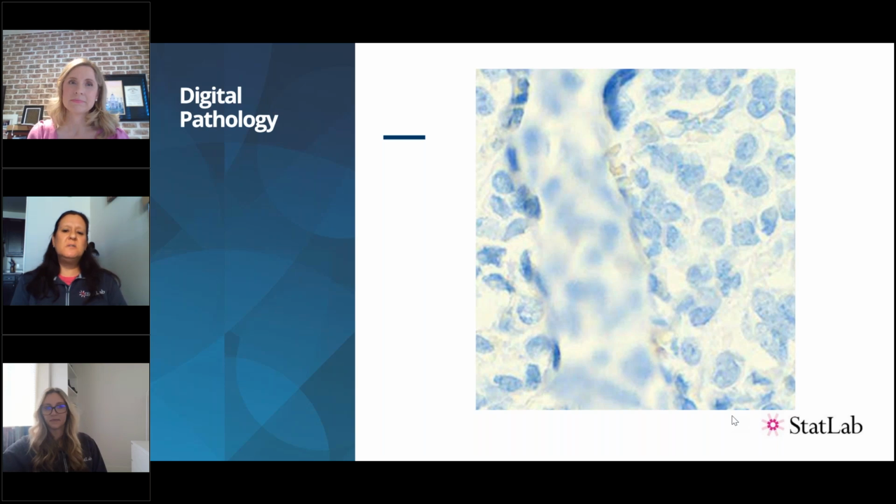So this is fairly new to me as well. This was a piece of tissue where, when I was just looking around the slide, I saw an area that looked like maybe there was some excess mounting media left on there. Maybe it wasn't dried quite as well. It was an area where we couldn't really see what was going on in that piece of tissue. So maybe it was as simple as having to rescan it again, or this might be a situation where you have to go back and look at the tissue, maybe microscopically, and recut and restain and start over as well.